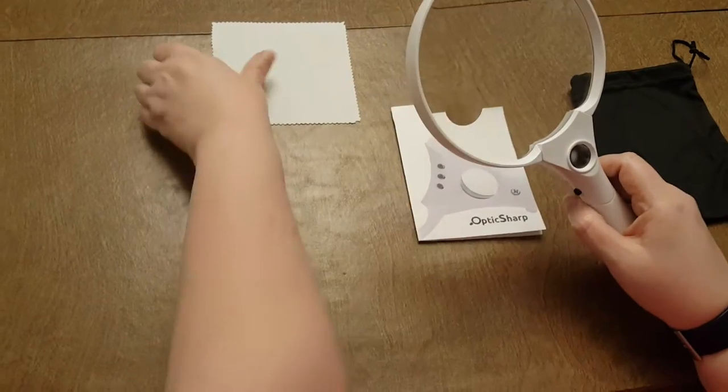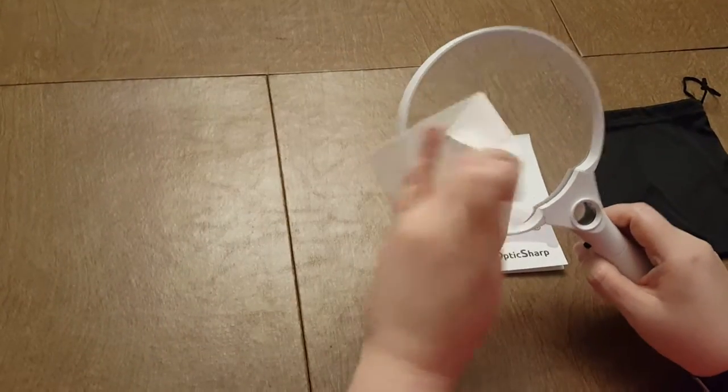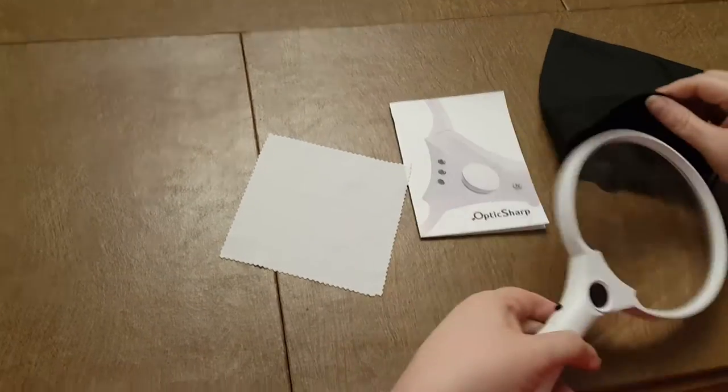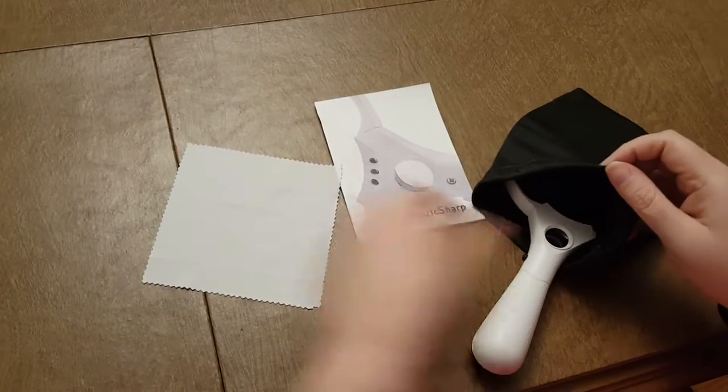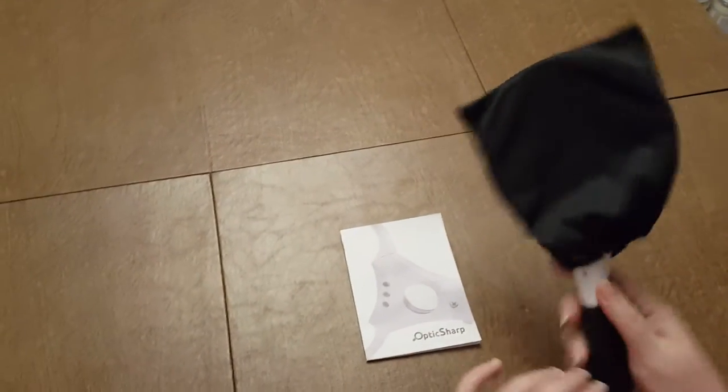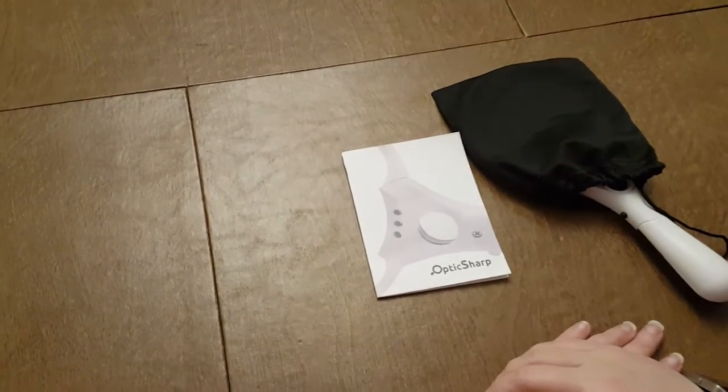This kit also comes with a cleaning cloth so you can keep your lens nice and clean. And a storage bag. So you can just slide it in, slide your cleaning cloth in, tighten it up, and put it away. It will keep it from getting dusty and keep it from getting smudged.